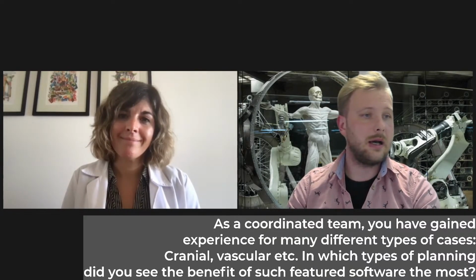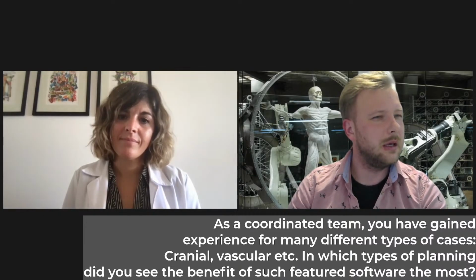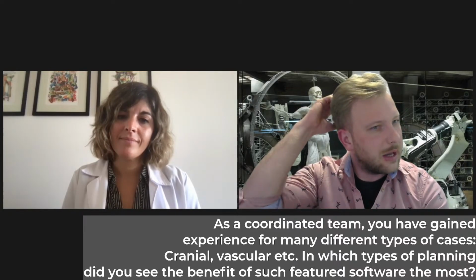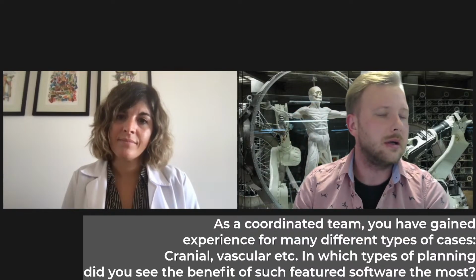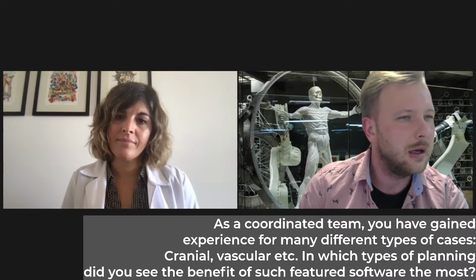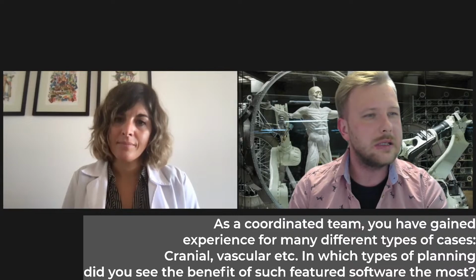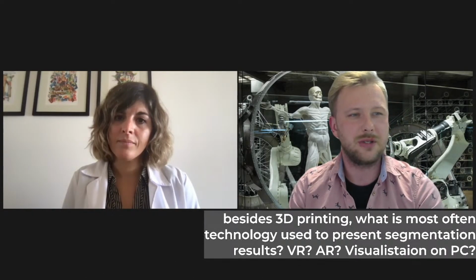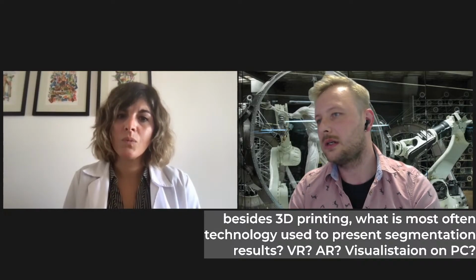Great. And I guess the last one will be, yeah, we have questions about the certification. I will answer them at the end. And the last question from Powell, I guess. Besides 3D printing, what is the technology most often used to present segmentation results? VR, AR, visualization on PC, or whatever?